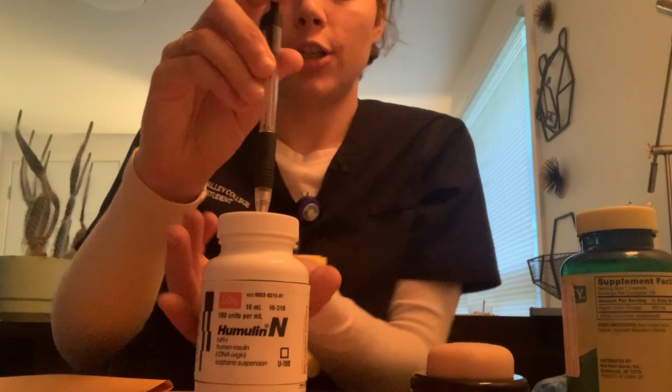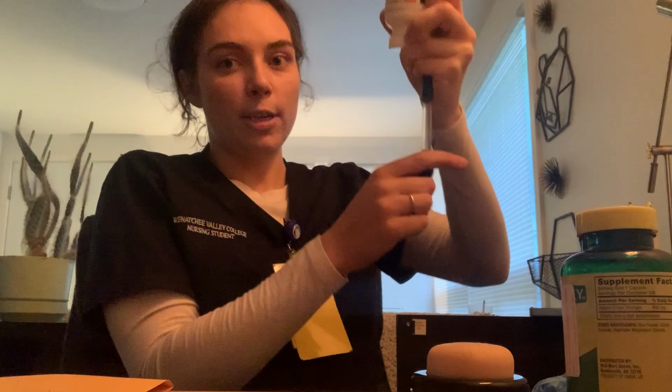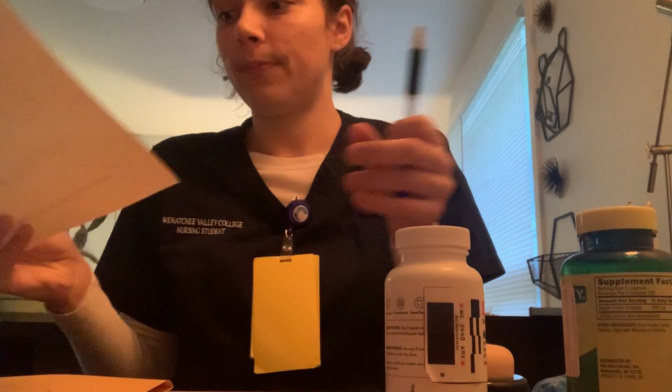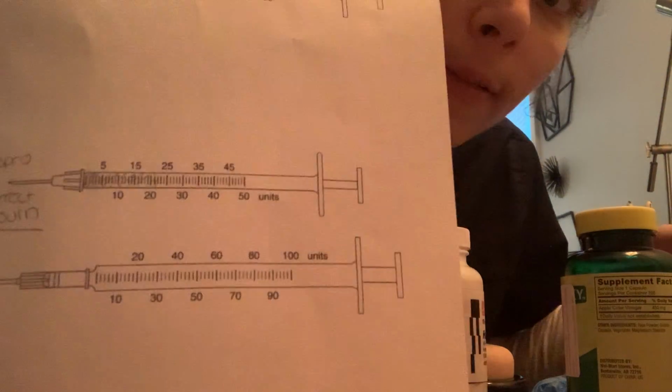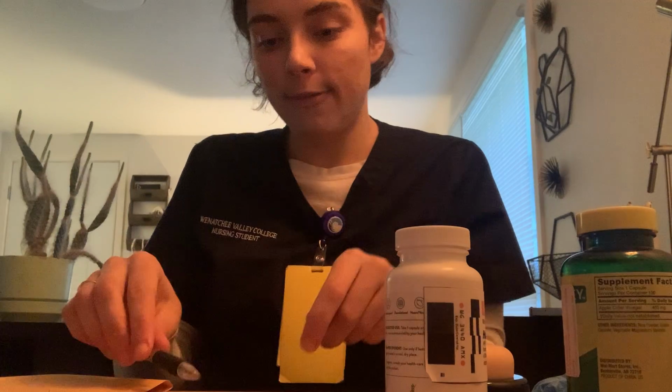We are then going to inject into our NPH, invert, pull back all, there should be 21 altogether, checking for bubbles, having our nurse verify, and you will see that on that top one that's filled out there. She's gone through the carb count already and verified our dosages for each. She has confirmed. We recap safely.